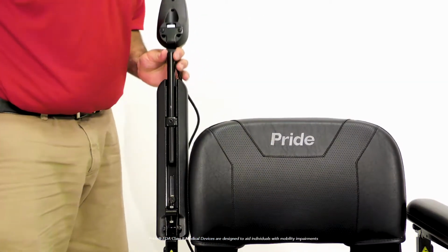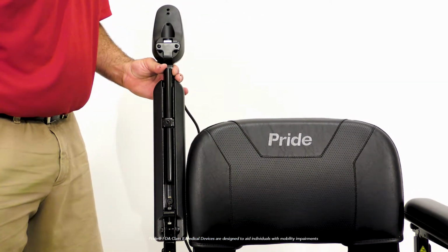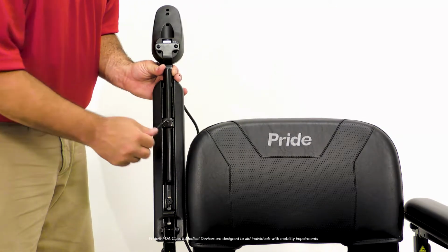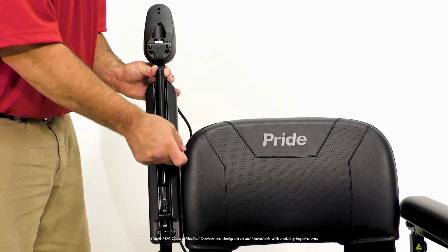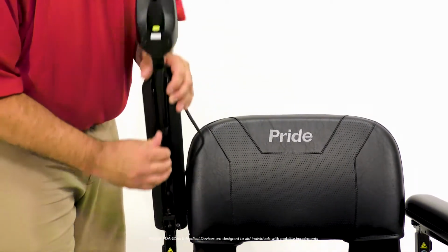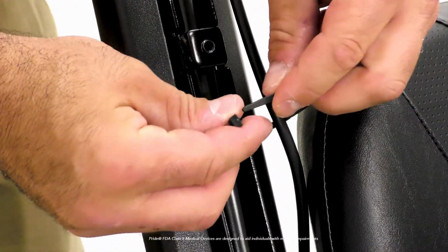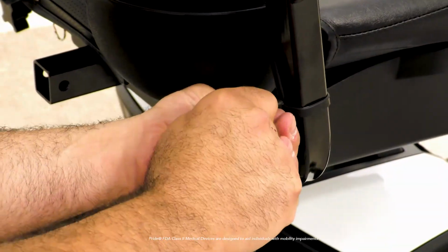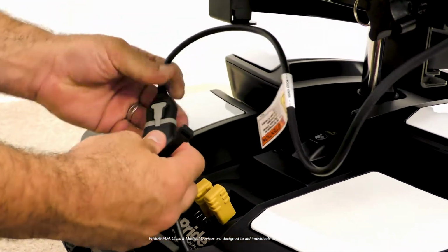The armrests are universal for mounting the joystick, so once you determine the joystick side, slide the joystick mount in the armrest and tighten the set screw with the 4mm Allen wrench. Use the wire ties to secure the harness to the hole under the arms. Connect the joystick to the power module harness.